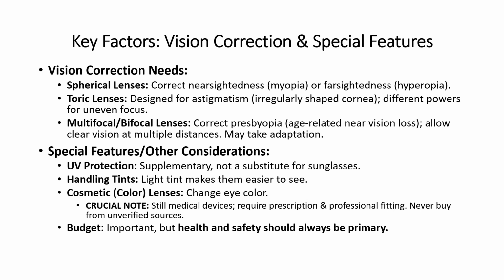Beyond correction, lenses can also come with special features. Some offer UV protection, which is a good supplementary layer but never a substitute for high-quality sunglasses. Handling tints are light tints that make the lenses easier to see. Then there are cosmetic or color lenses, designed to change your eye color.